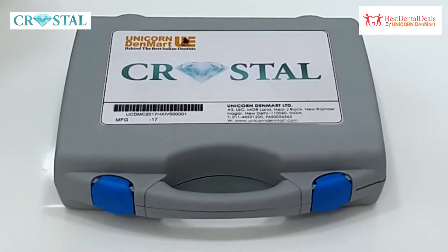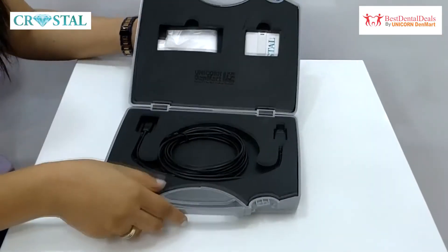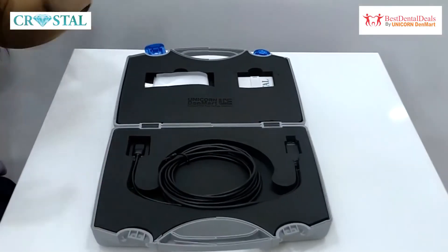As you can see, the RVG box is small, compact, and portable, making it convenient to pack, store, or carry to clinics.